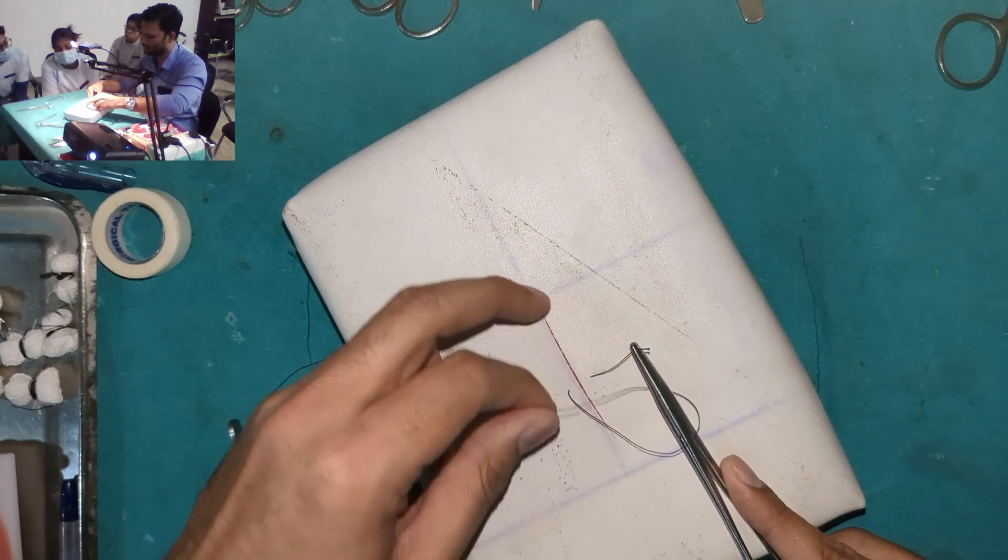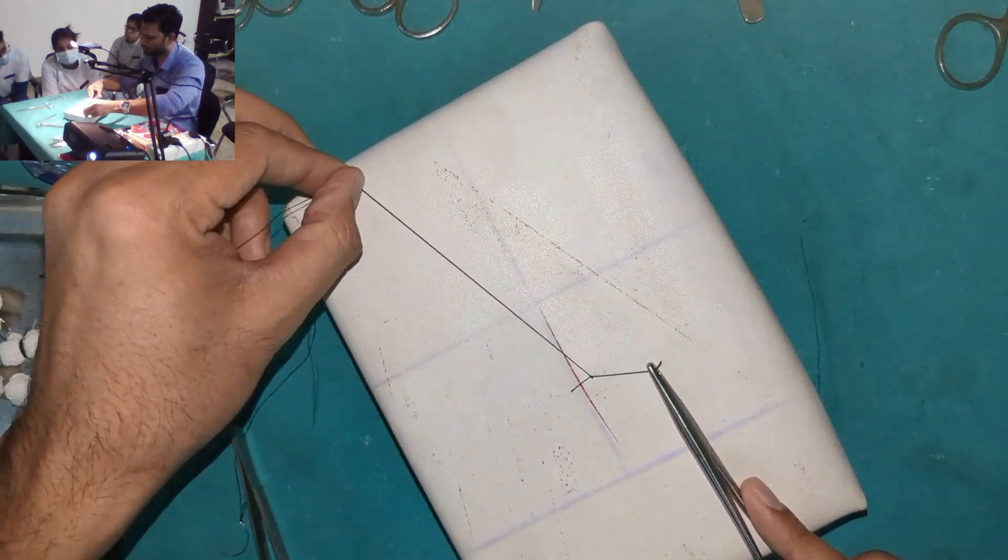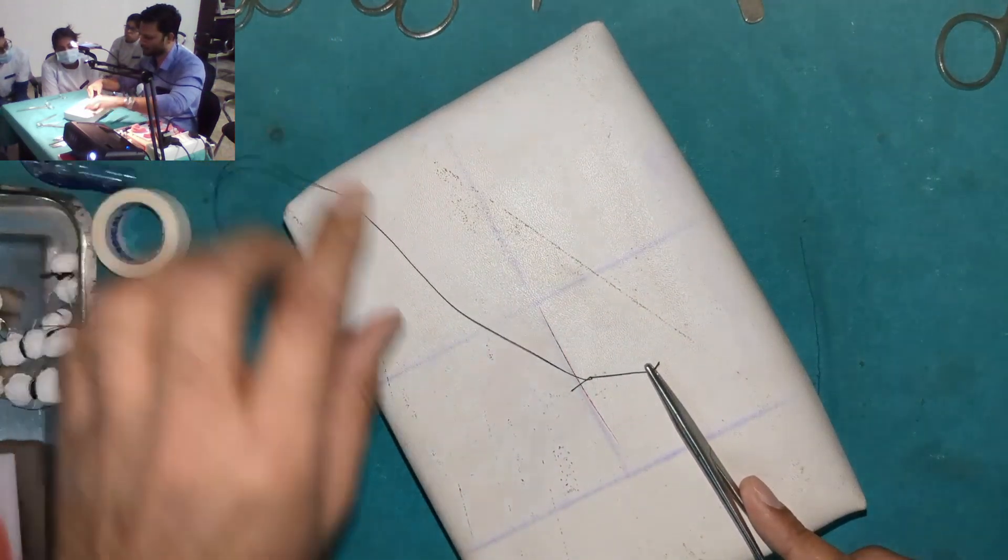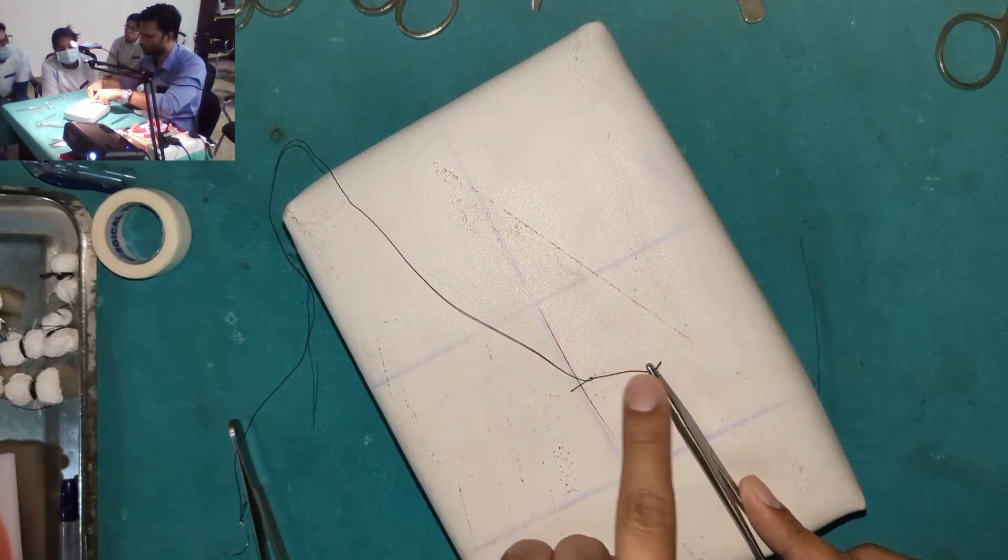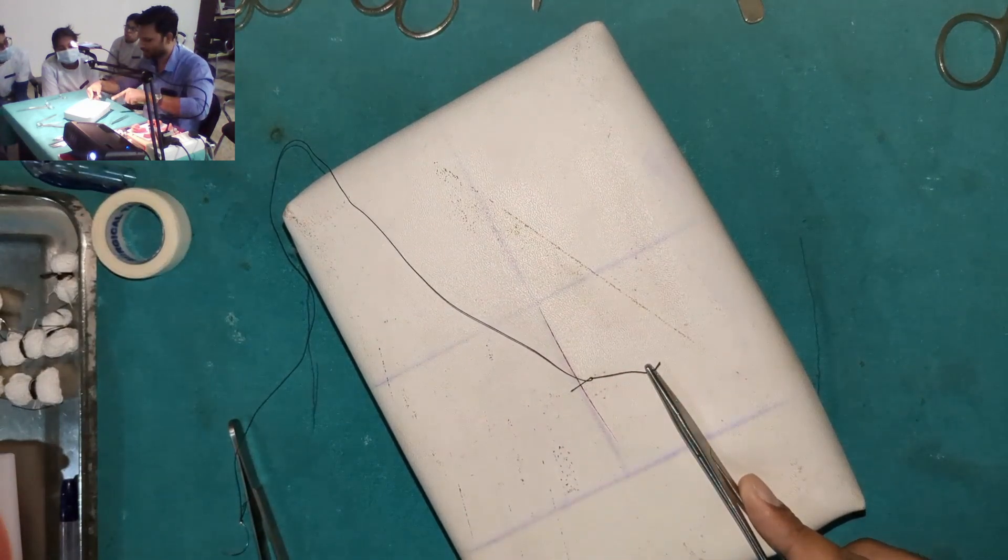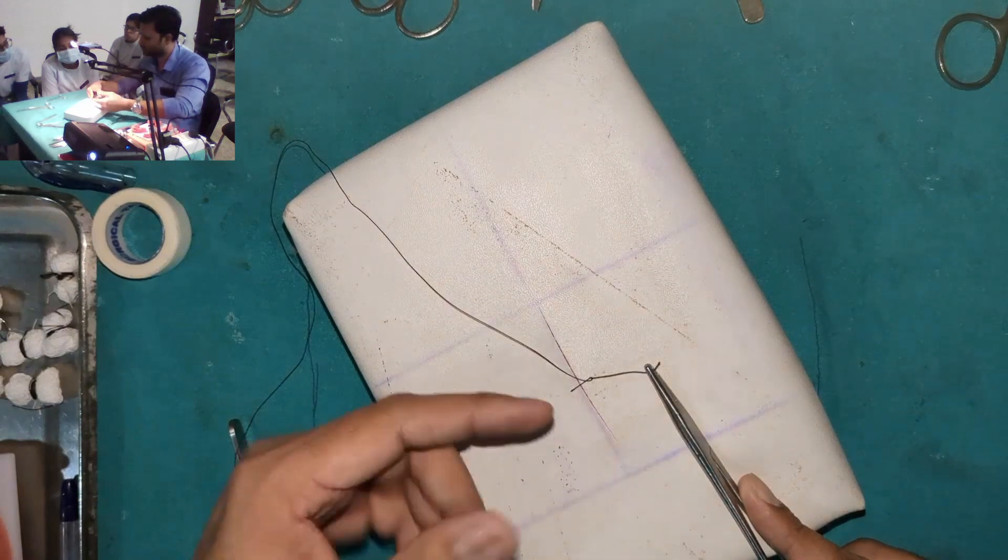Now I'm going to keep it slightly taut, and when I pull the suture, can you see, automatically the knot is going there. This thread is going to act as a guide. It is going to act as a guide for the knot.